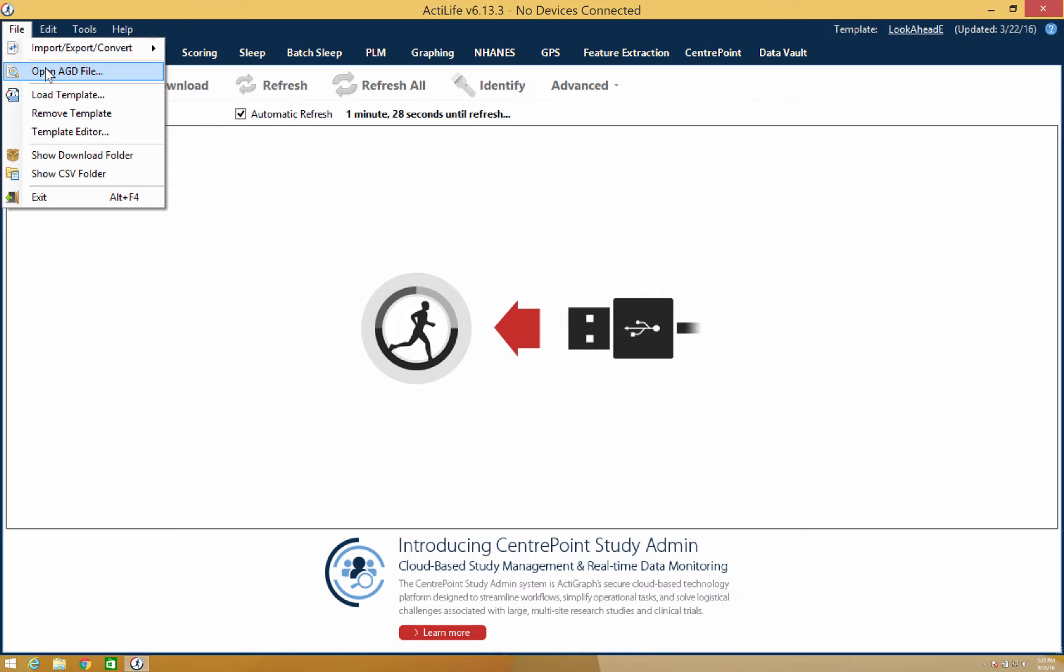Just beneath the Import, Export, Convert option, you'll find where you can open your .agd files. By selecting this option, you'll automatically be taken to the directory where your .agd files are stored.